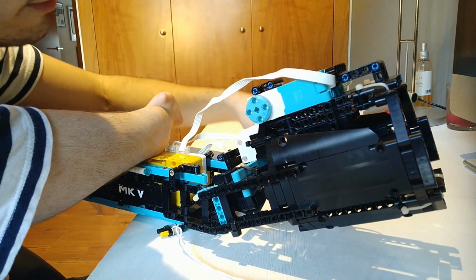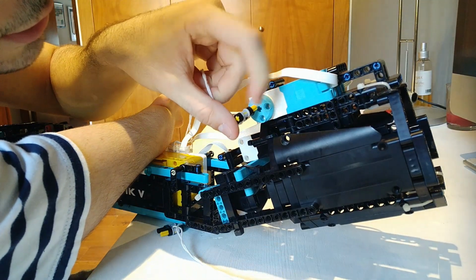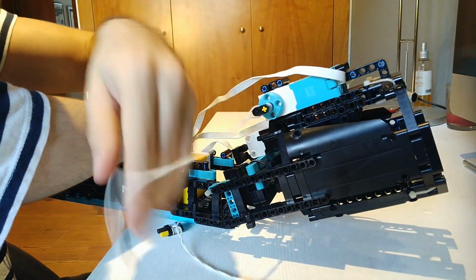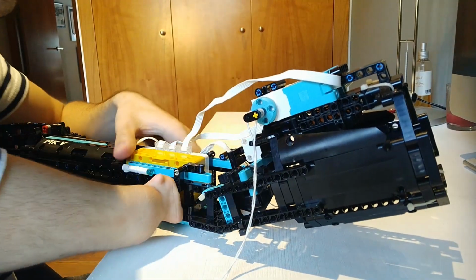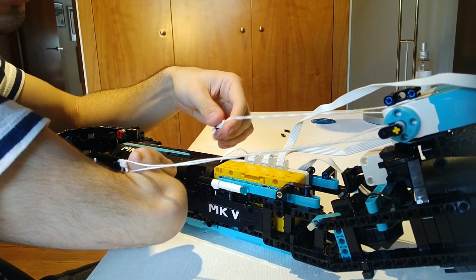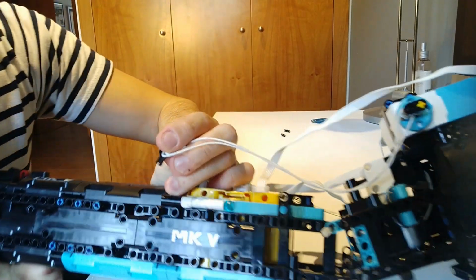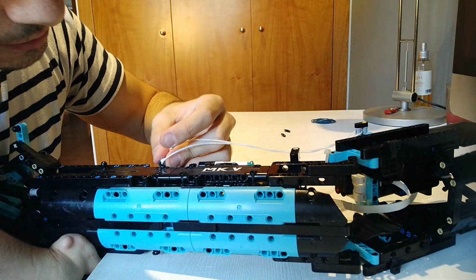The connection is really simple. You need to take the yellow axle on the center on both sides. It should look like this. One here and one here. Now you're going to pull the cables to the front and connect them where they are connected in the instructions. So one cable is connected right here.